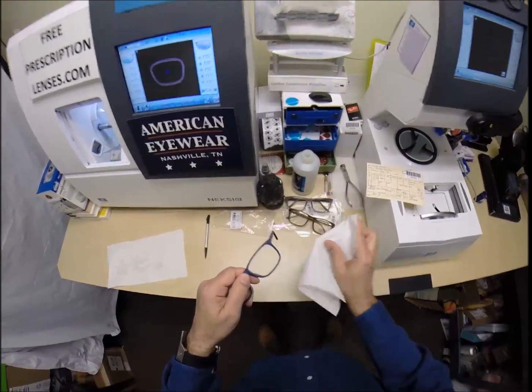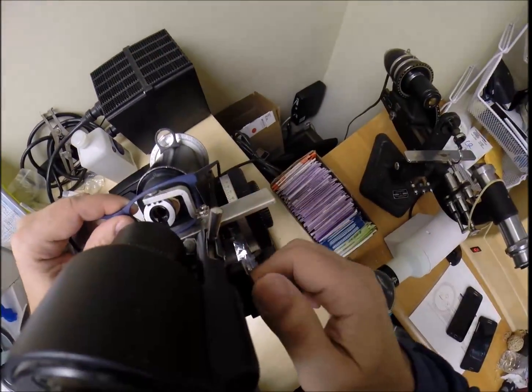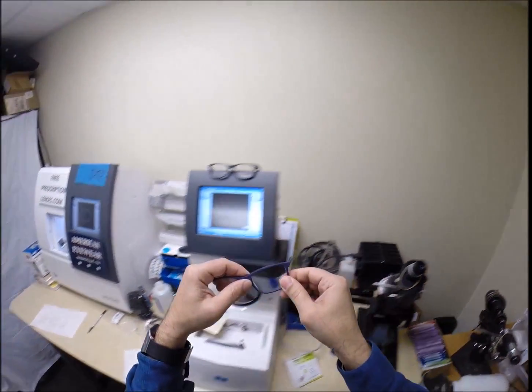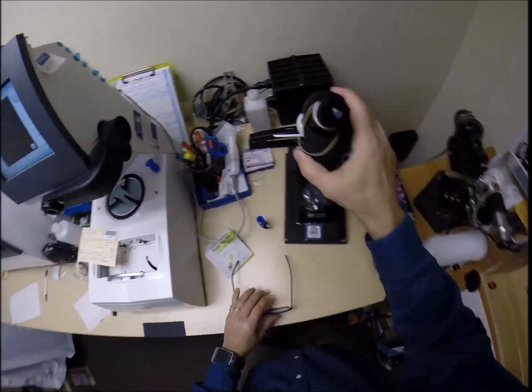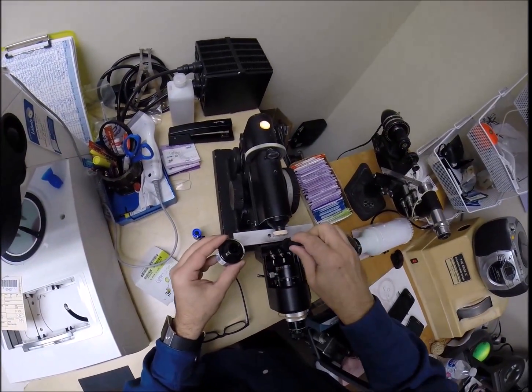Up, hang on, hang on. I did not measure the pupillary distance. Let me find the center of the lens again. Put a little dot onto the lens. Is the dot there? Come on, I gotta ink this already. This ink dries so quickly. I've got to get some more ink.